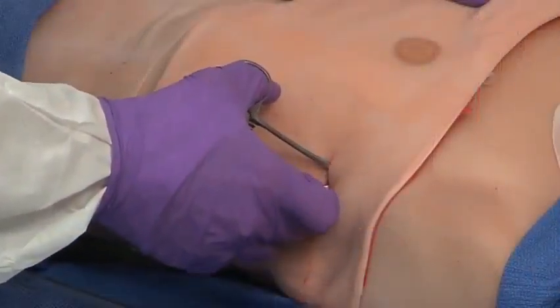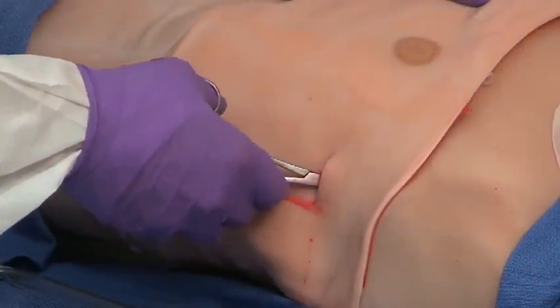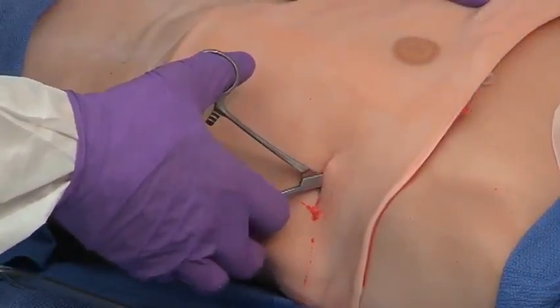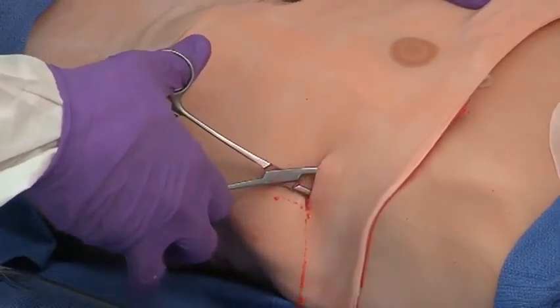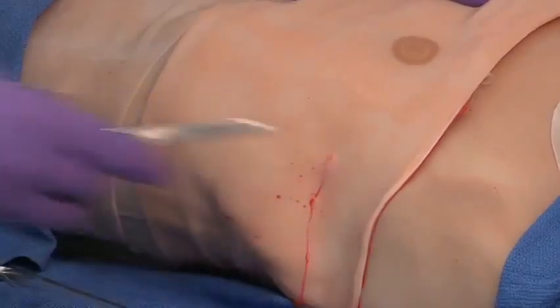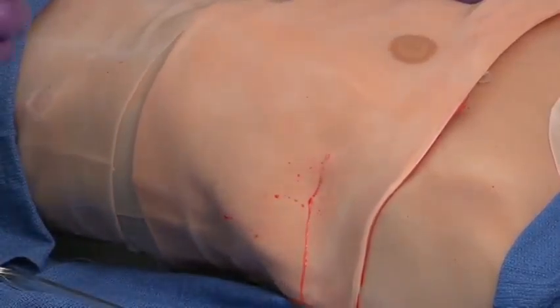Once you've done this, you want to then spread, close your clamp a little bit, spread again. The idea is you want to make a hole large enough that you can put both your finger in, first of all, and then this large tube once you're done. I now have a hole in the chest.